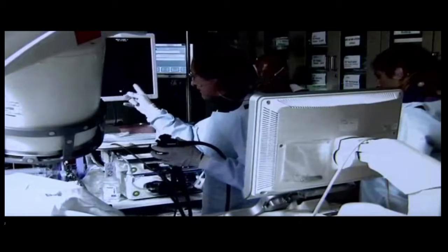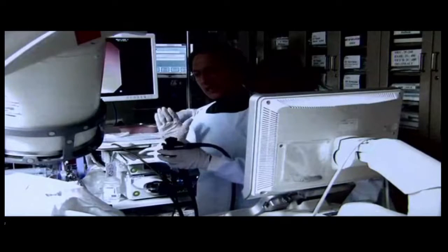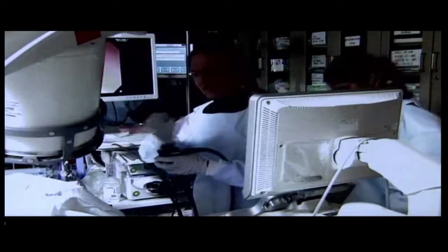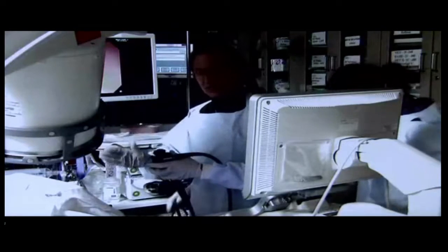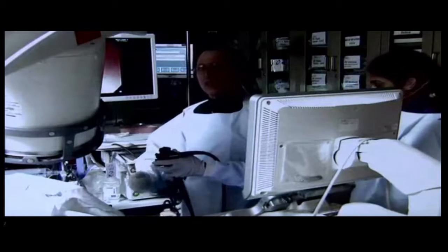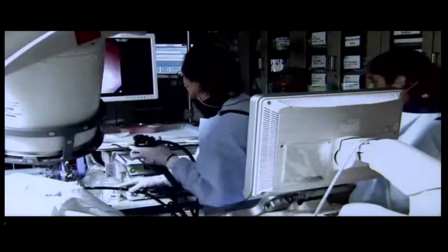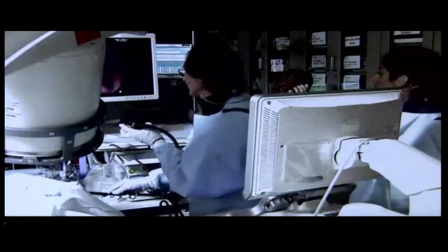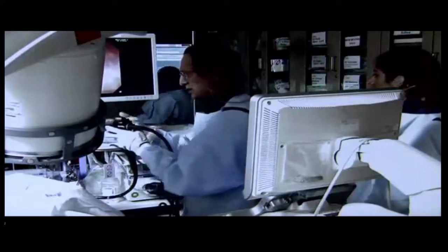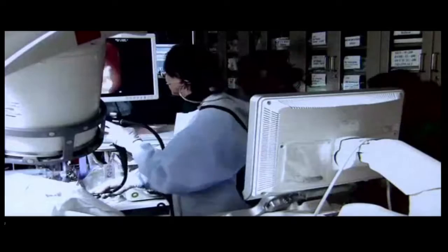Just waiting for an endoscopic image here, and then I can pass the EUS scope. And what we're going to do is just very quickly look from the duodenum at the pancreatic head, just to be sure we're not overlooking some mass. That was done before, so I don't expect to see anything. And again, I think that her story is entirely consistent with a pancreatic duct stenosis, or I should say orifice stenosis. I'm interested quickly. I think that's a great indication for this procedure, and we've all had patients with pancreatitis and divisum. How successful are you with that?